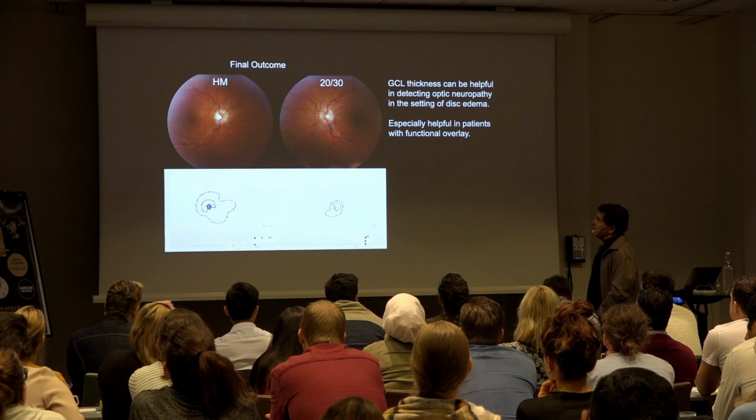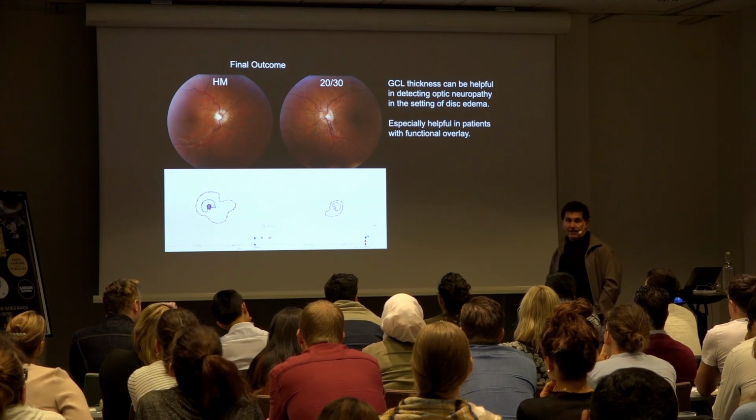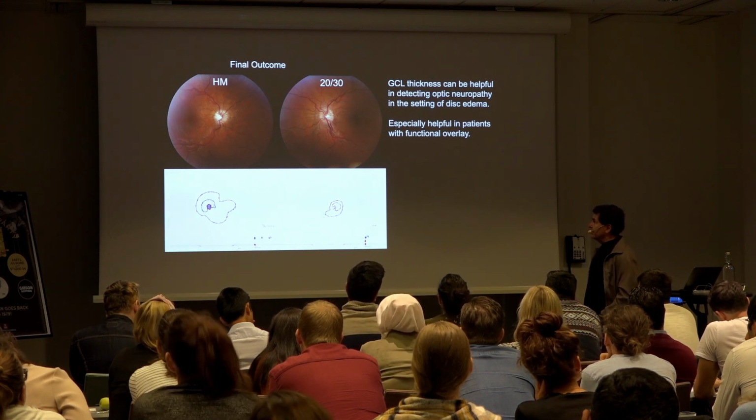So in this setting of raised intracranial pressure, when you're seeing ganglion cell loss in the setting of disc edema, that's a bad sign. And those patients probably need to be treated pretty aggressively.